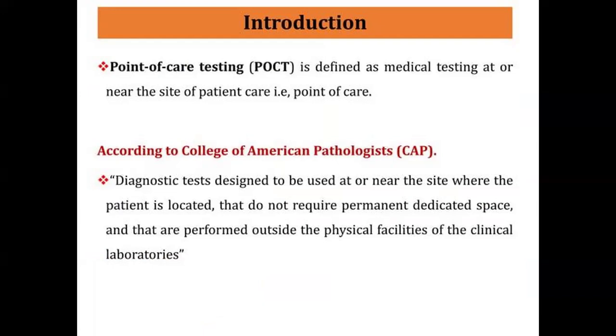Most diabetic persons carry a glucometer with them at home or wherever they go. This glucometer will analyze the sugar concentration. Whenever you feel a little dizzy or uneasy or have any problem, you can just keep one drop of blood and check what the glucose concentration in your blood is. Accordingly, you can take remedial action like taking a medication or whatever rest you require. This is very useful, especially when you understand you have some variations in certain components of your blood.